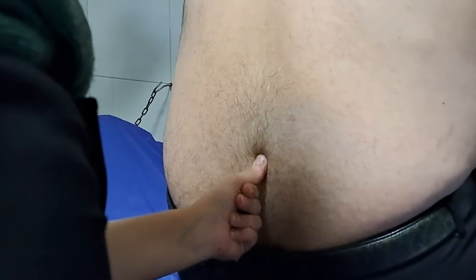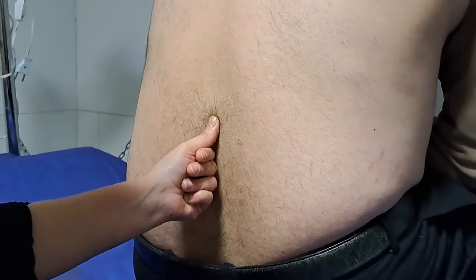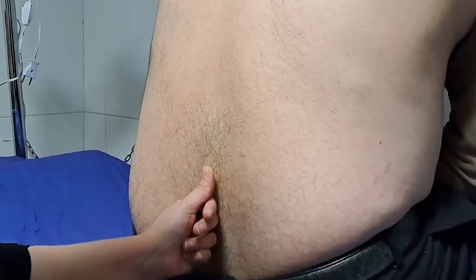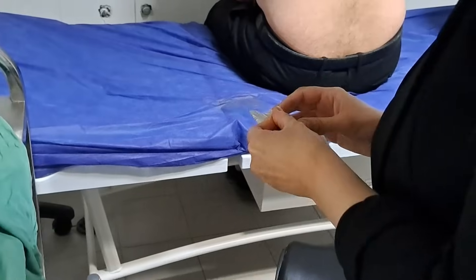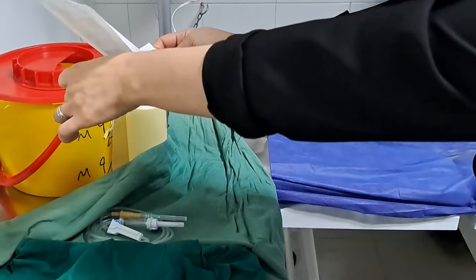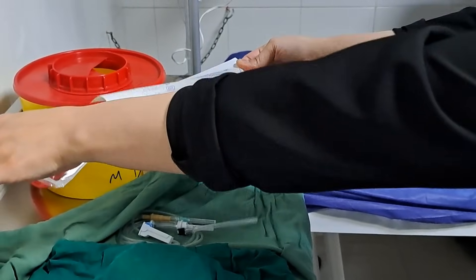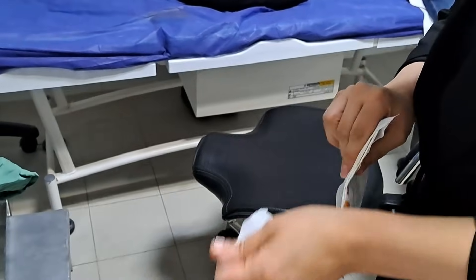In this video you are going to watch how a lumbar puncture is done and how we measure brain pressure. Lumbar puncture is a procedure in which a doctor inserts a thin needle into the lower part of the spine, especially the lumbar region. The needle is inserted into the space between two vertebrae to access the cerebrospinal fluid, or CSF.